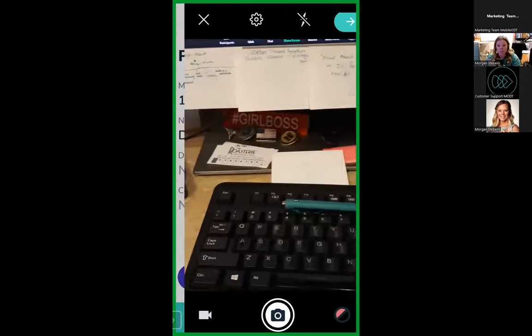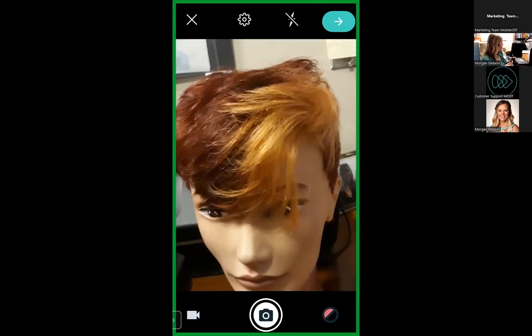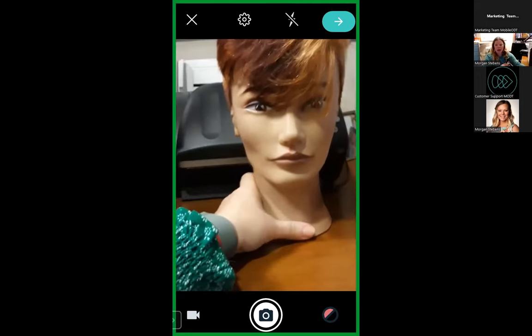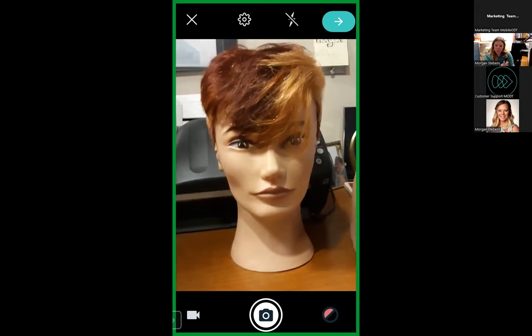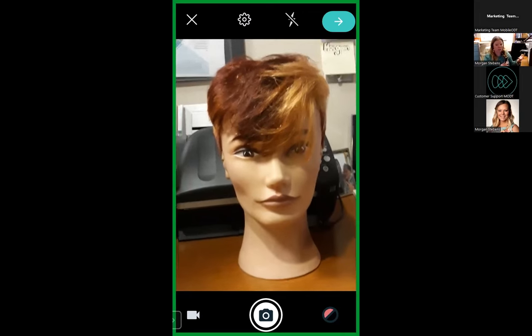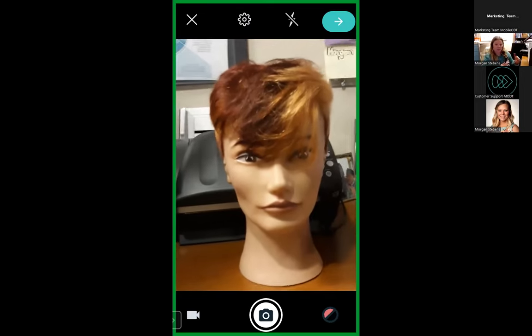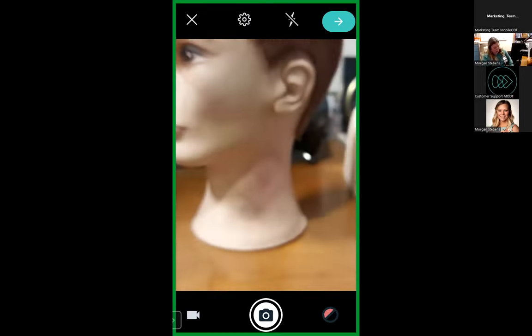So it's gonna pull up my camera. So what you're gonna see is my camera. And I have some models over here that we're gonna take a look at. So this is Strangulation Susan. She is our mannequin that we utilize with our patients who have been strangled. And so what they'll do is they'll demonstrate how they were strangled on her and we'll take a photo of it. But what I've done with her today is I've created some injuries so that you can see her injury.